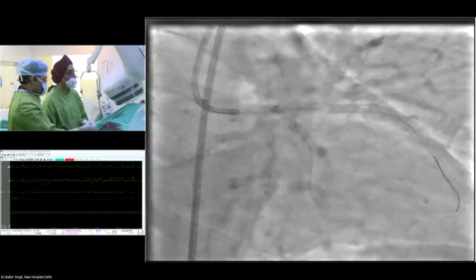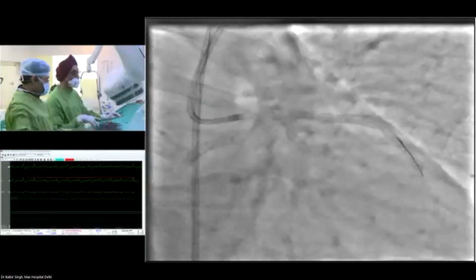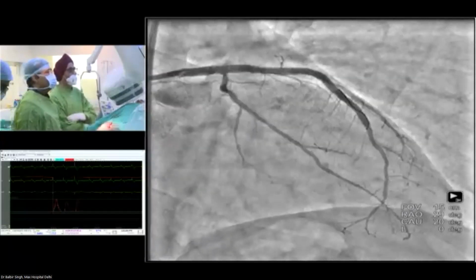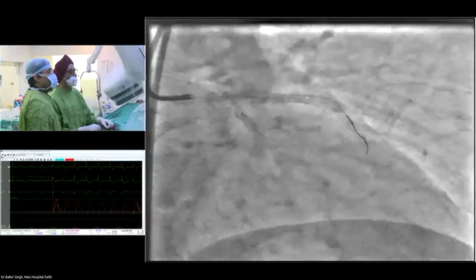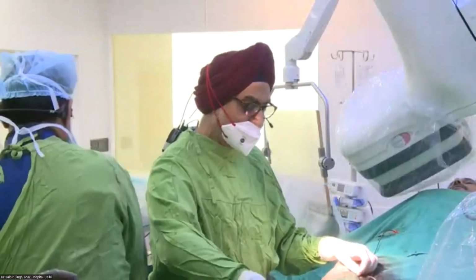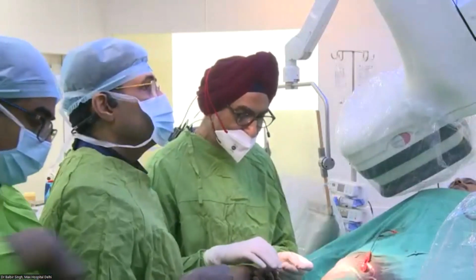Yeah, perfect. It's a really very, very challenging case, and you could show us how to manage this perfectly. And I think what we saw now by angio, the final result is perfect. This looks good to me. I'll do the very final POT and imaging, and that should be all. Yeah, perfect. So would you go now with OCT and IVUS or just one OCT only? OCT only. I think I'll be able to see the ostium of the circumflex without having to recross it.